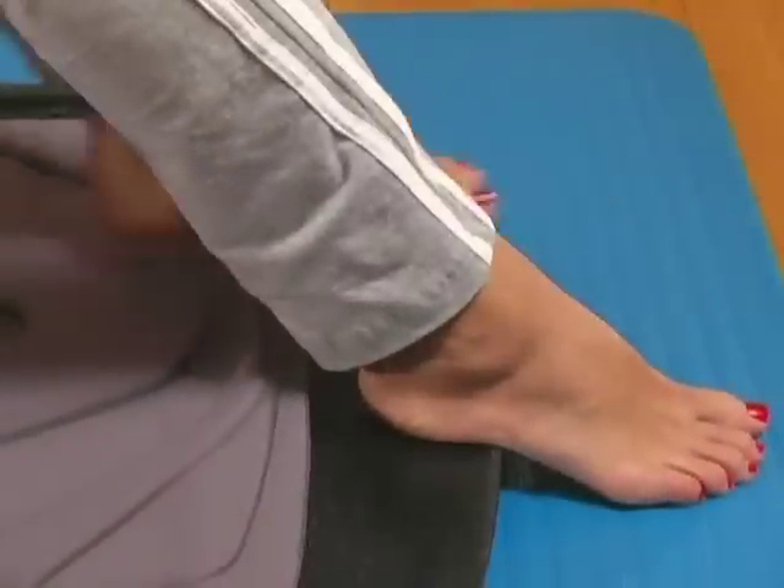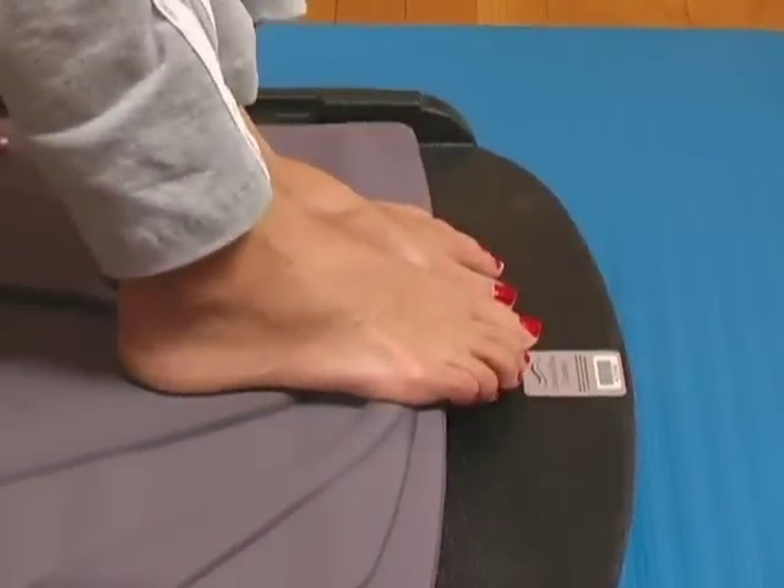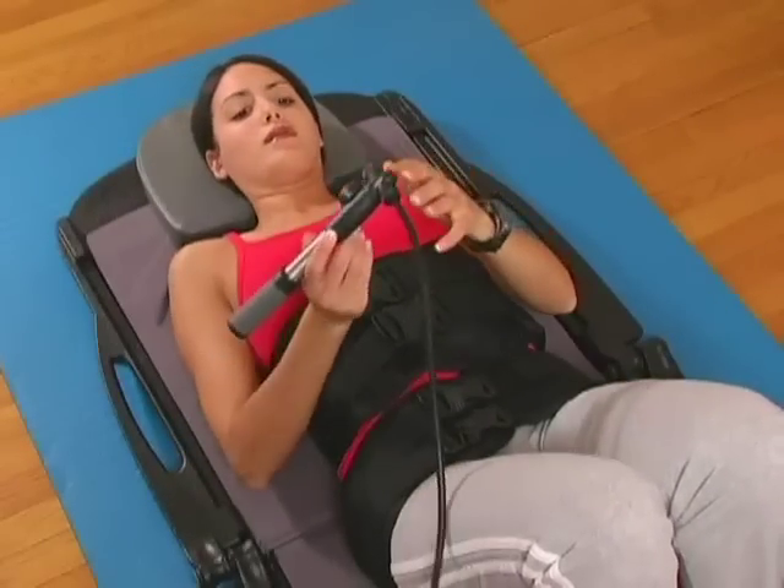Place your feet on the cushion or the floor while being careful not to impede the motion of the traction device. Now you are ready to begin gradually pumping air into the air cylinder.